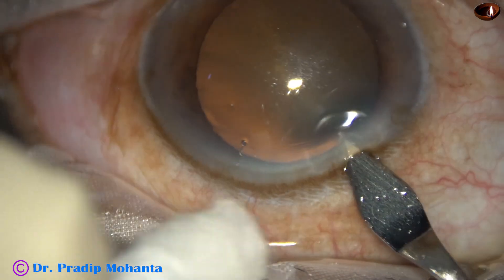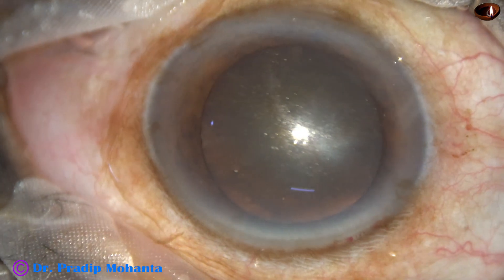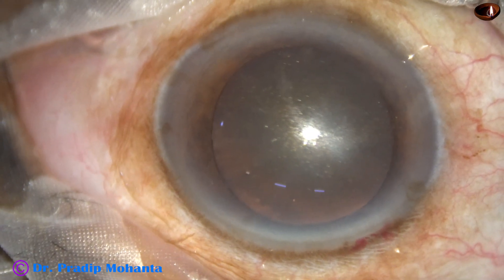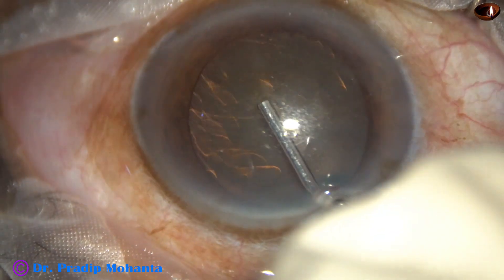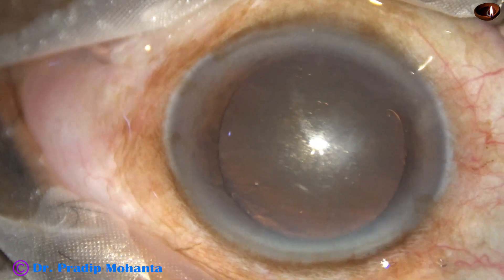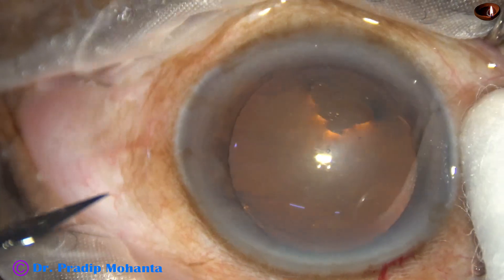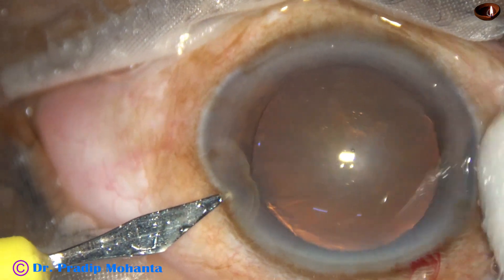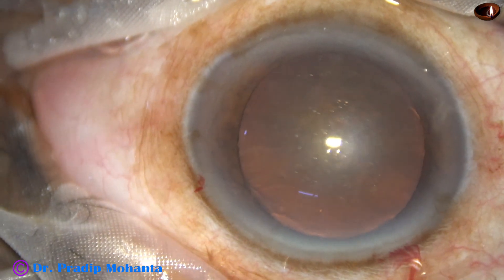This is the main incision with a 2.8 millimeter steel keratome at mid-limbus. The anterior chamber is filled up with 2% hydroxypropylmethylcellulose. A side port is done on the left side of the main incision, about three clock hours away.